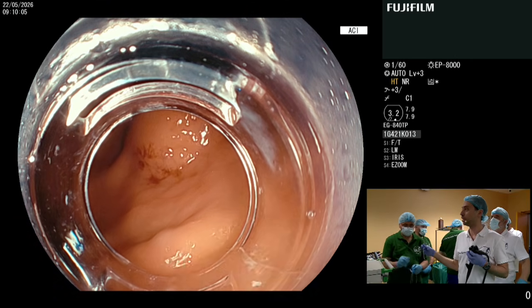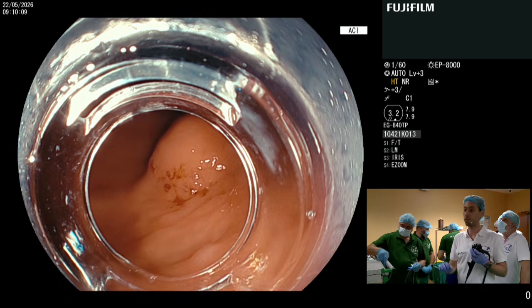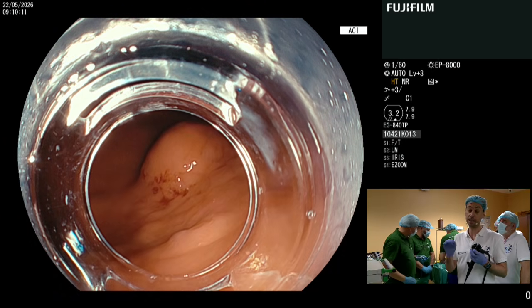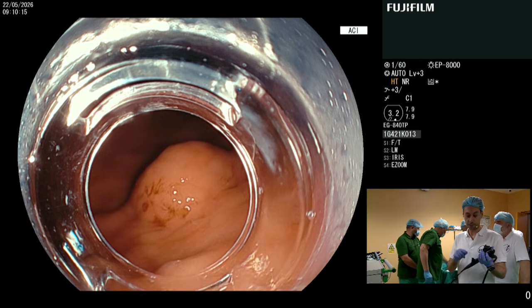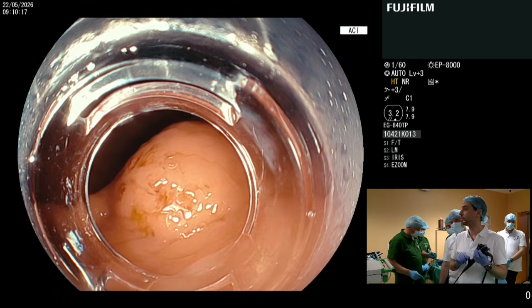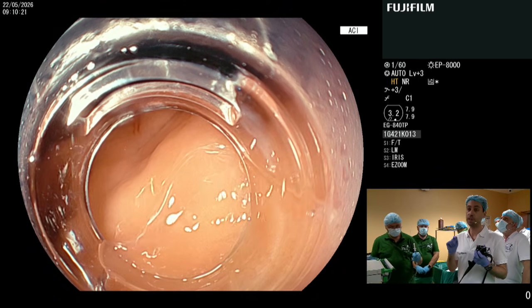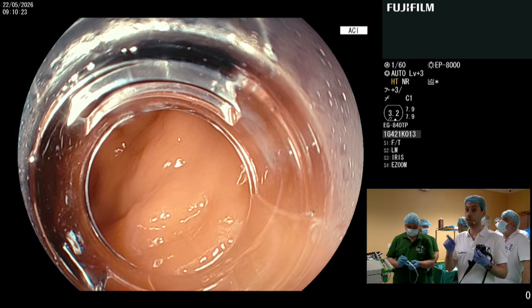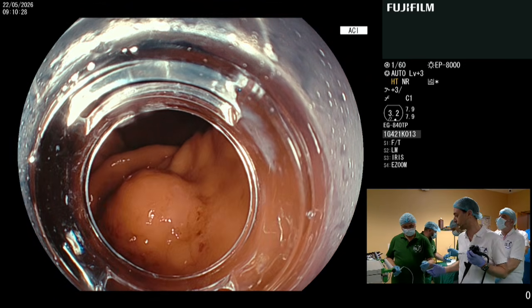Our endoscope is a very slim endoscope, 7.9 millimeters in diameter. It is called 840 TP. It is the newest endoscope by Fuji, and it has the advantage of a large therapeutic channel and a water jet. So this is the ideal slim endoscope for tunneling.